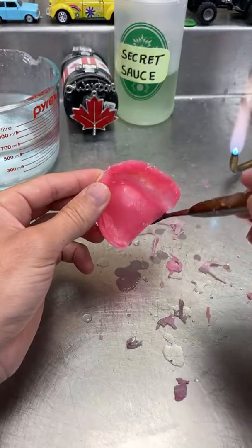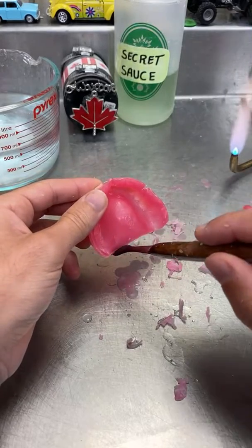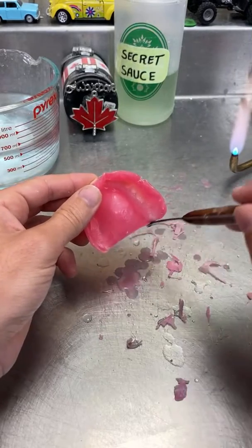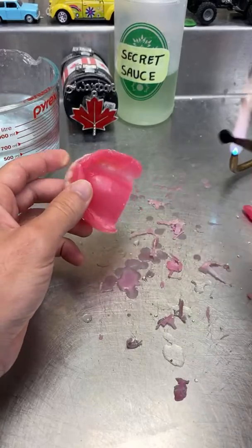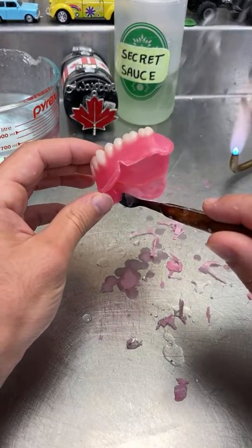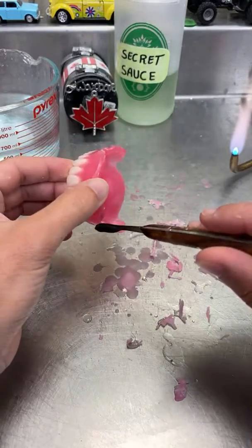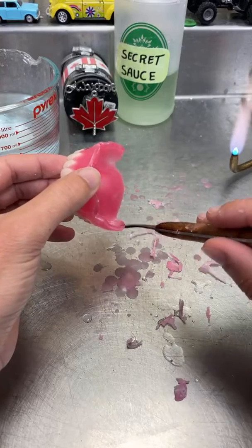So you basically just go with a hot spatula here, and that will save the dimensions and there won't be any distortions on that. Make sure you get all the frenums.